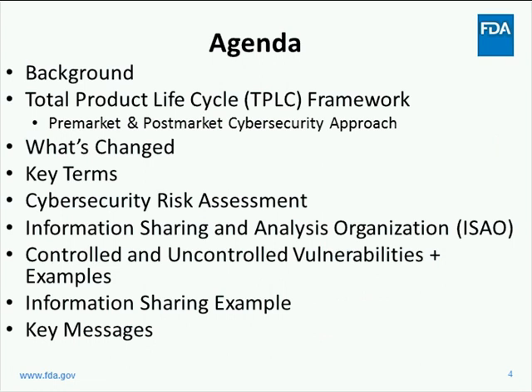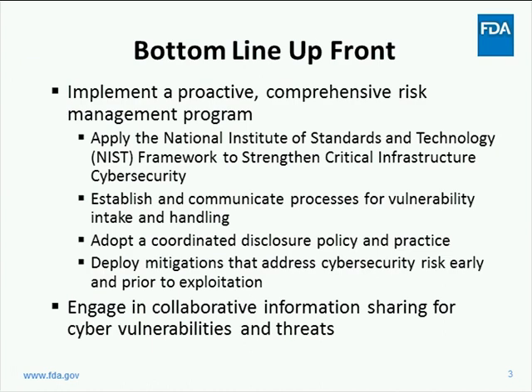Bottom line up front, addressing medical device cybersecurity means implementing a proactive, comprehensive risk management program that incorporates these key tenets: applying the NIST framework to strengthen critical infrastructure cybersecurity, establishing and communicating processes for vulnerability intake and handling, adopting a coordinated disclosure policy and practice, deploying mitigations that address cybersecurity risk early and prior to exploitation, and very important, engaging in collaborative information sharing for cyber vulnerabilities and threats.